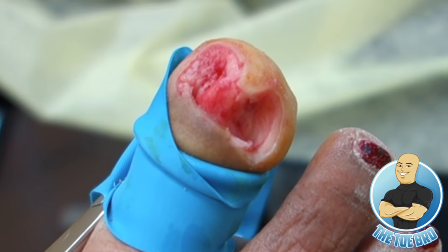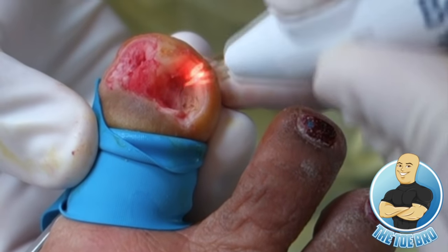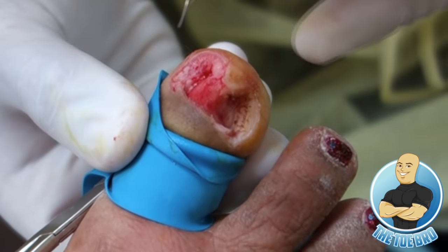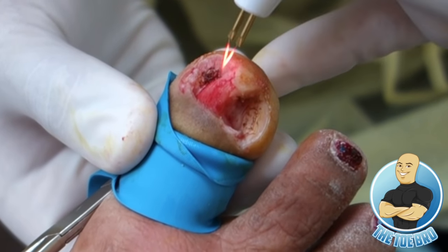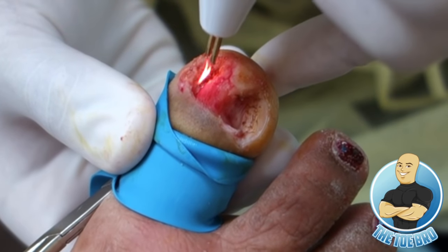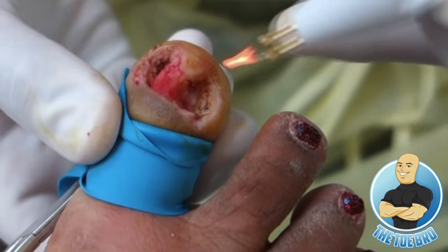Now that I feel comfortable that I've removed as much of the warty tissue that was present, now I'm going to be applying electrical cautery to damage any remaining wart tissue. As you can see, there's still very little to no blood at all. This has allowed me to really make sure I can see exactly what I'm doing. We apply just a light layer of electrical cautery to the warty tissue. I try to avoid the nail bed. We're going to be using the chemical to go over the warty area and then apply that to the nail matrix to stop any sort of nail from growing back.